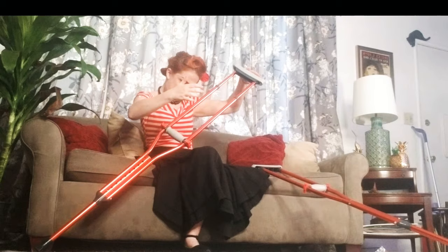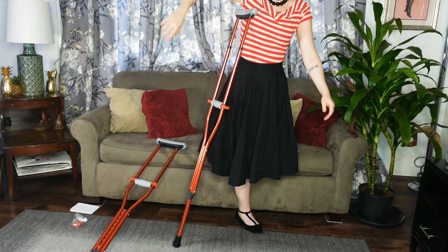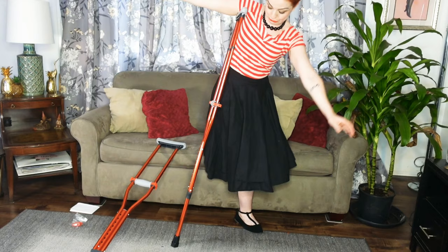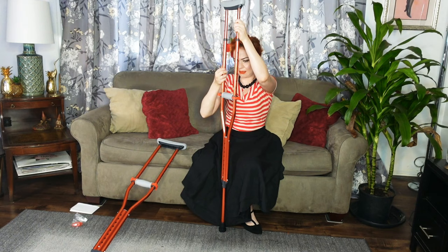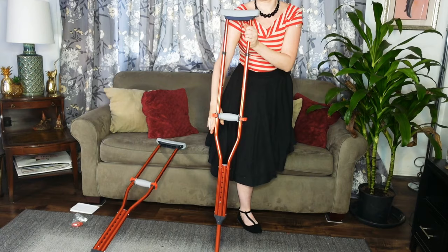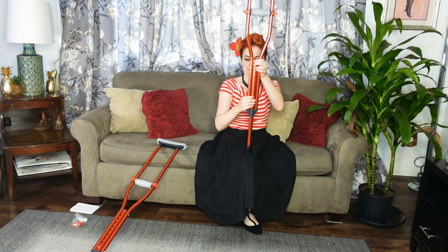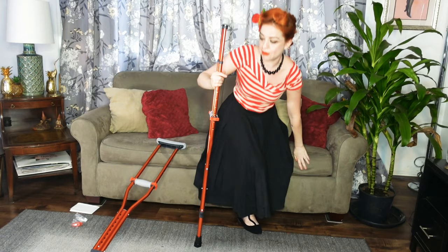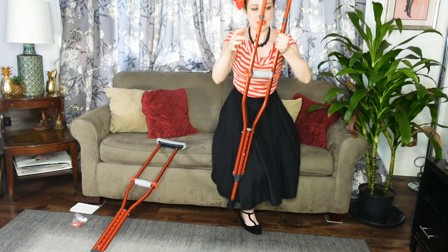Oh, it worked! Okay, that one wasn't quite right, so let's try this — there we go. Whoa, that's too high! Okay, let's see if we can go down a little. I think that height... okay, it's still just a little bit too high. Let's go down one more — that's four. Okay, that seems still just a little bit too high — going down one more.